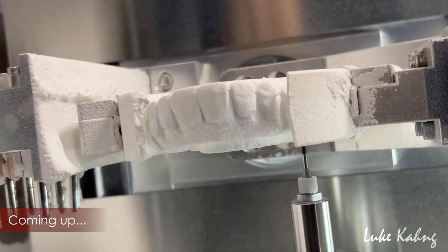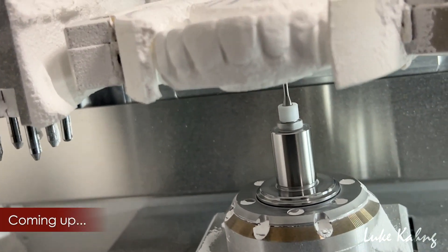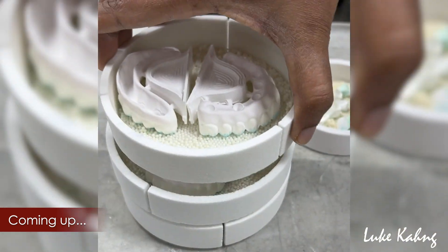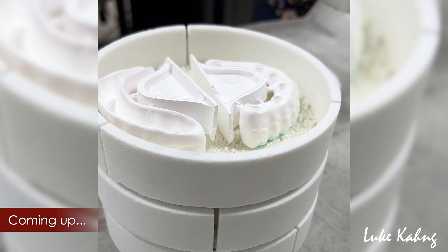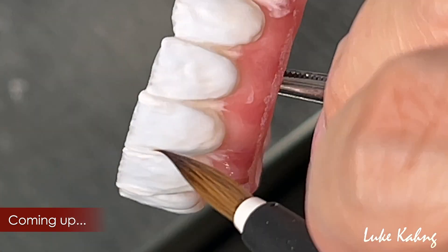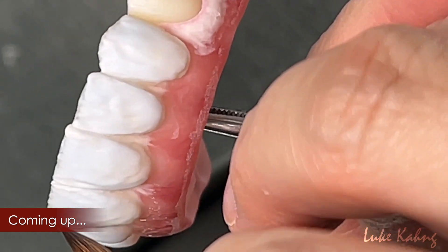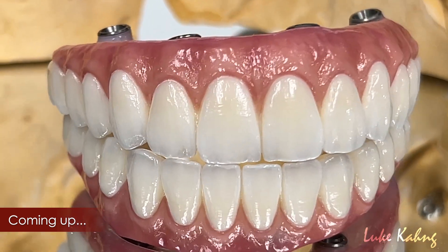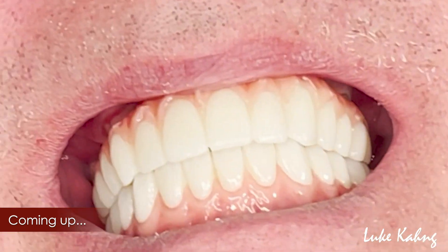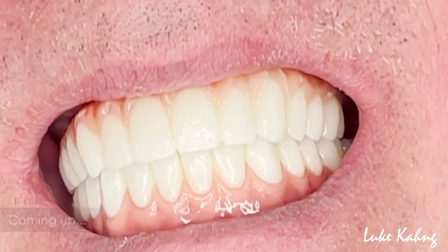Zirconia arch implants are some of the best dental restorations for patients. They are also a popular restoration here at LSK 121. But what are the general steps that we take when creating these kinds of implants, and how do we make them look so lifelike? In this video, we'll take a quick look at the fabrication of our aesthetically pleasing, full mouth zirconia implants.